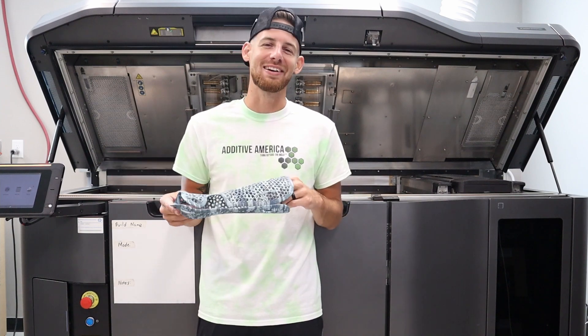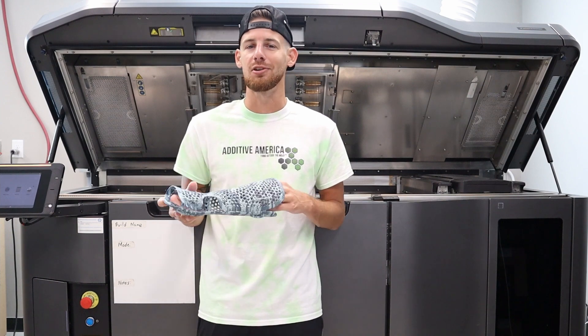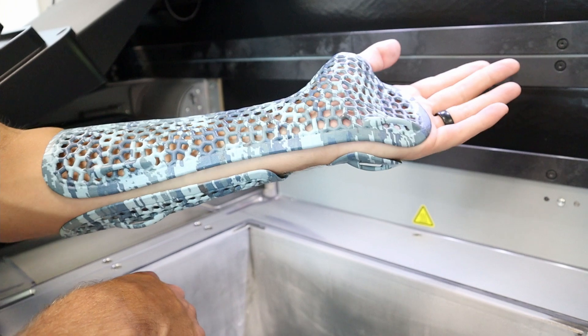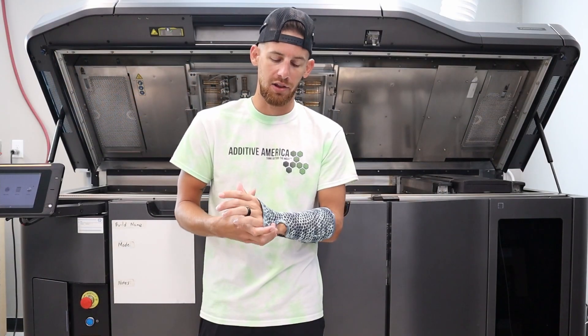What's going on? My name is Zach Holcomb with Additive America. Today I want to show you this pretty cool color arm brace that we printed on our HP 580 machine in full color, and then we had the AMT vapor polish treatment done to it to lock those colors in, make it nice and smooth and shiny.